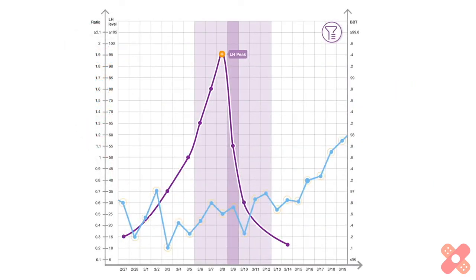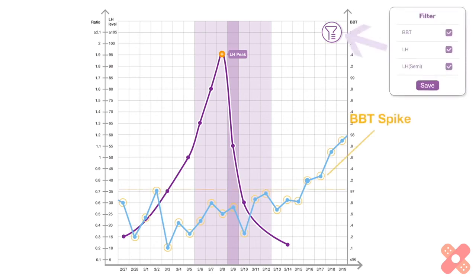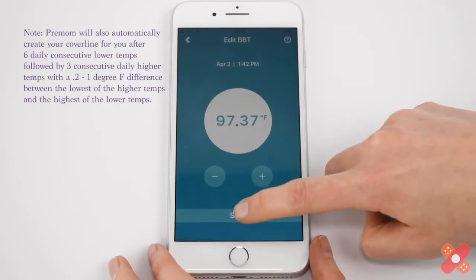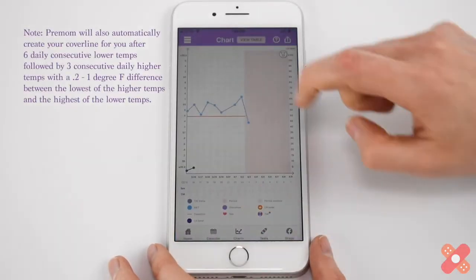Analyze your results at any time. Get a quick view of results on the Premom app home screen. Check the progression of your temps in charts. If you see a BBT spike, that may indicate that you have ovulated. Need to edit your temp? Edit from any of your BBT screens.